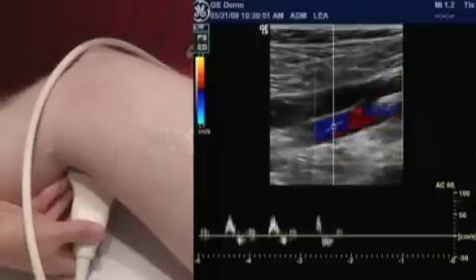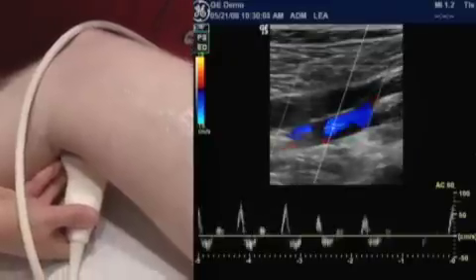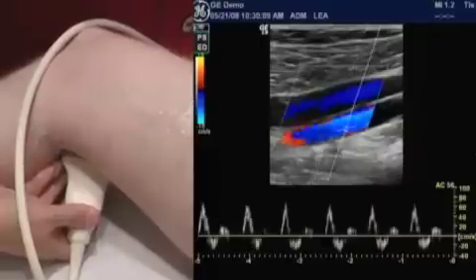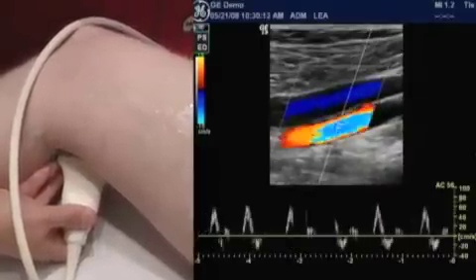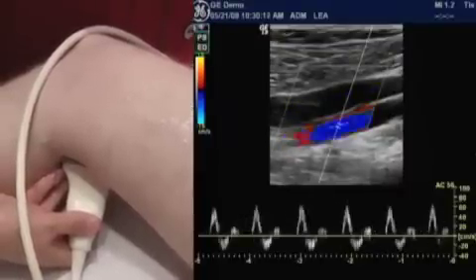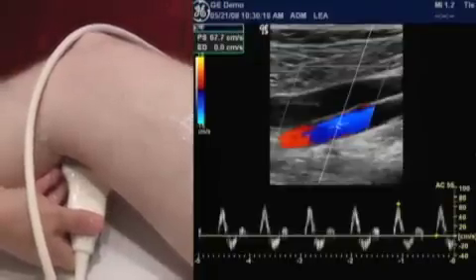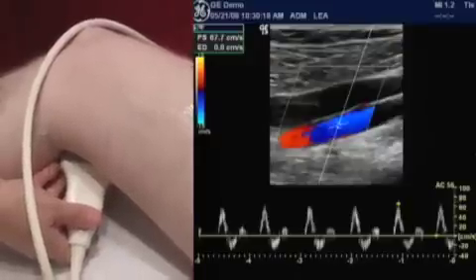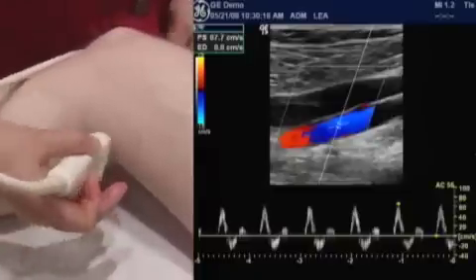And now here for our Doppler, we'll want to give us a little more angle. 60 degrees is perfect, but less than 60 is okay. In here, without having to fuss too much, I've adjusted it. Now I'm at 56 degrees. And again, multiphasic, high, sharp upstroke, narrow peak, and so forth. That's a normal Doppler signal, and we're down to about 68 centimeters per second for velocity.